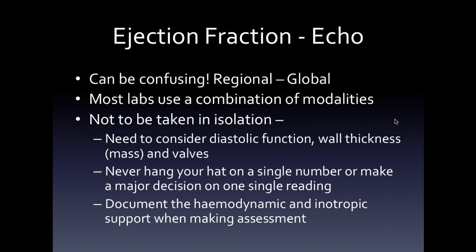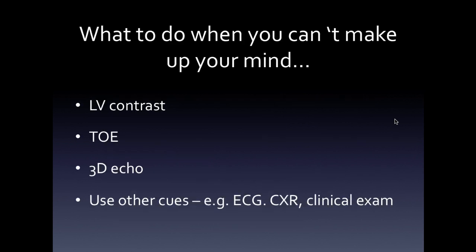your mind. And there are tricks, which, I'm not sure how many people use LV contrast. We use a moderate amount of it. There are downsides to LV contrast. I've seen anaphylaxis with it. There are contraindications to it. But it can be very helpful to opacify the left ventricle. It's particularly useful in stress echo, as it happens.